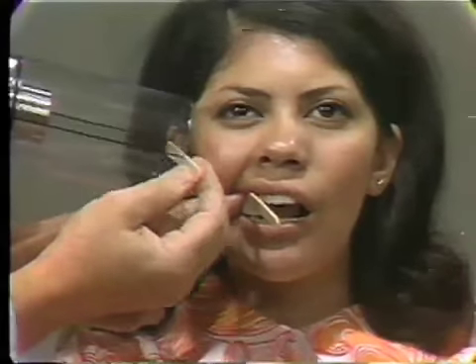When those two sticks, or those two lines, are parallel, then we're directing the rays in the proper direction. Now, the anterior-posterior positioning of the machine relative to the patient is such that the black line on the top of the cone is about opposite the outer corner of her eye.